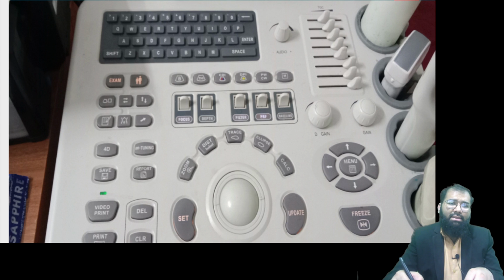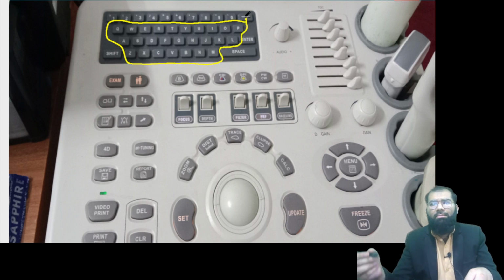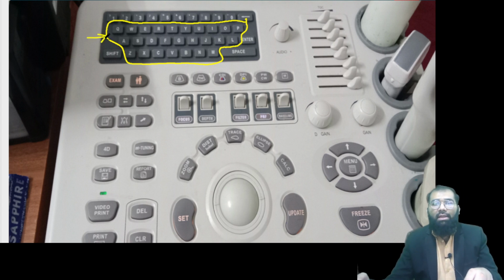So now let us see. You have got a group of keys here. These are all alphabetical keys, you can see here, these are alphabets. And this is just like your computer, PC or laptop, where you have these alphabetical keys and they can be used to enter the names, patient details, and if you're saving the case, what is the diagnosis.